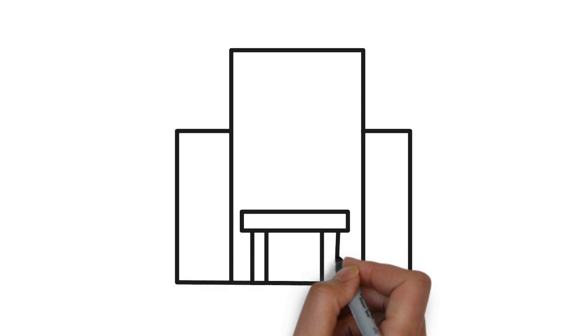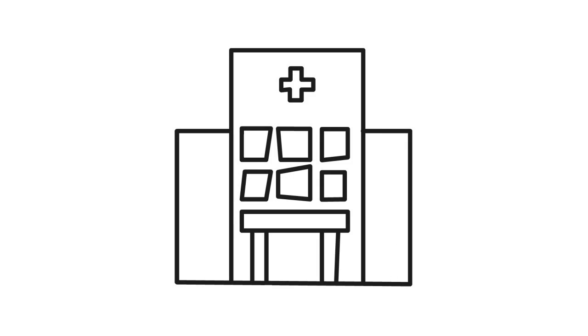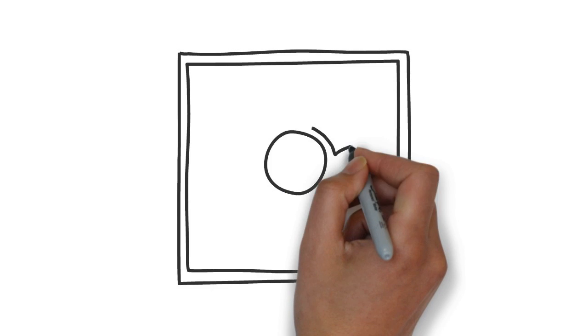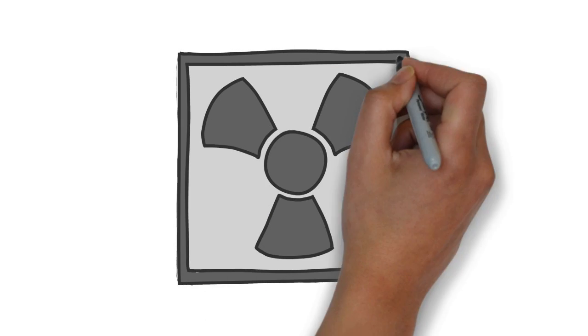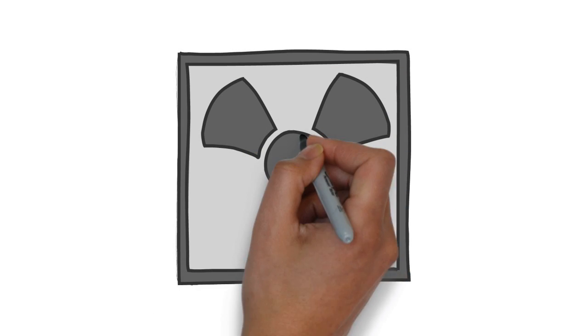So Cascadia Health Hospital is installing a new X-ray tube. Good job, GE. Before we start the X-ray running, we have to know how much dose the tube is expected to provide to patients and to workers. That means acceptance testing. We need to perform QC tests to measure it.